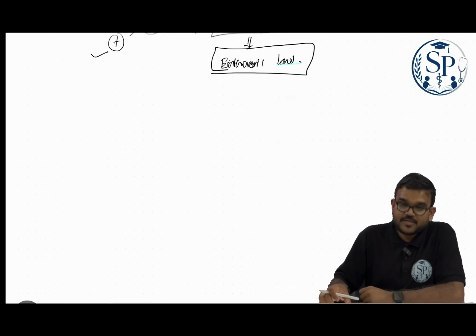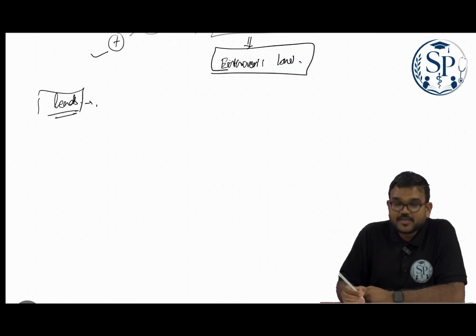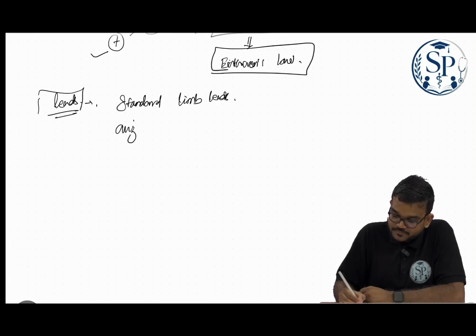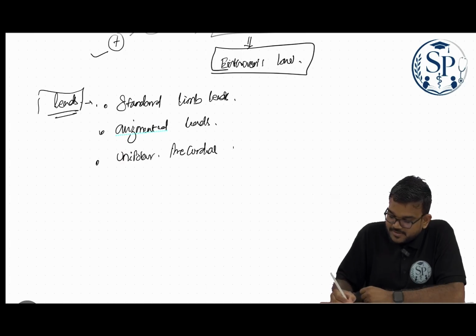Now there are various leads which you are using. There are standard limb leads, then augmented leads, then unipolar precordial leads.